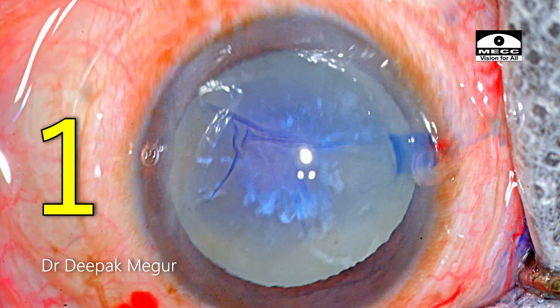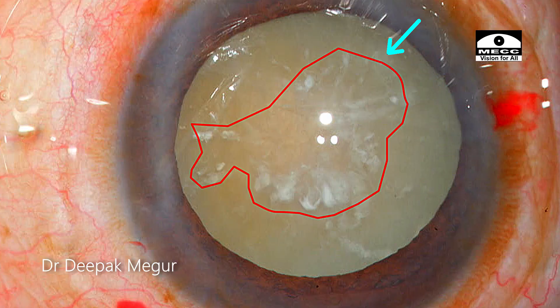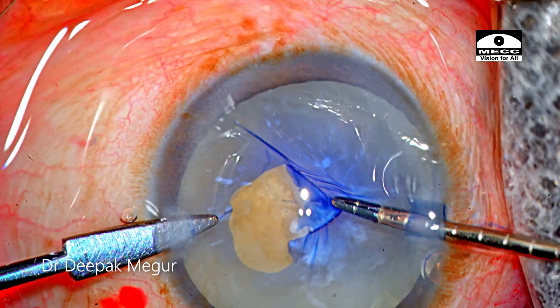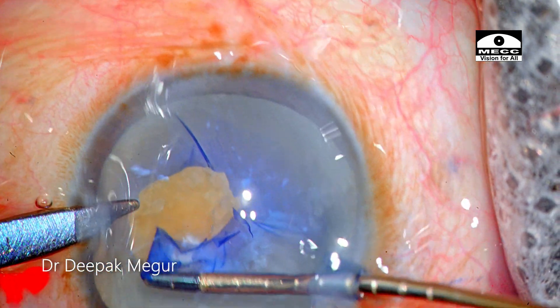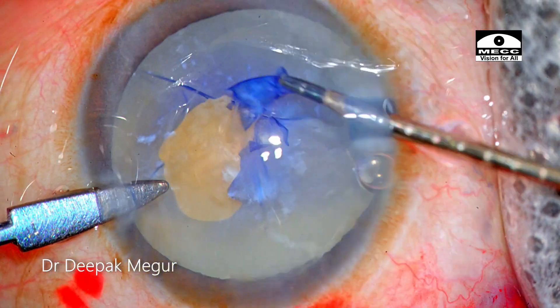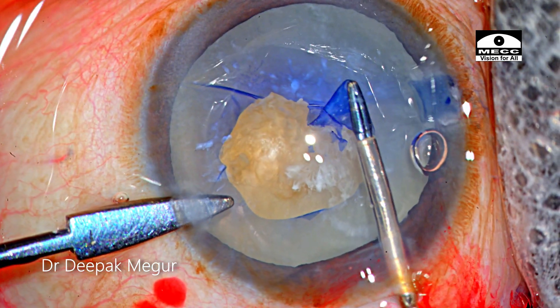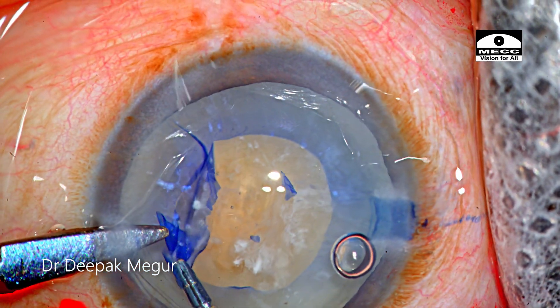To summarize the key messages from this video: Number one — in the presence of a central plaque of a calcified capsule that is not extending peripherally, rhexis can still be performed with relative ease as long as you work around it. We need to remember that the tear can become uncontrolled if we involve the calcific area. However, if the calcification is extending peripherally, it's quite difficult and a different technique will be demonstrated in later videos.